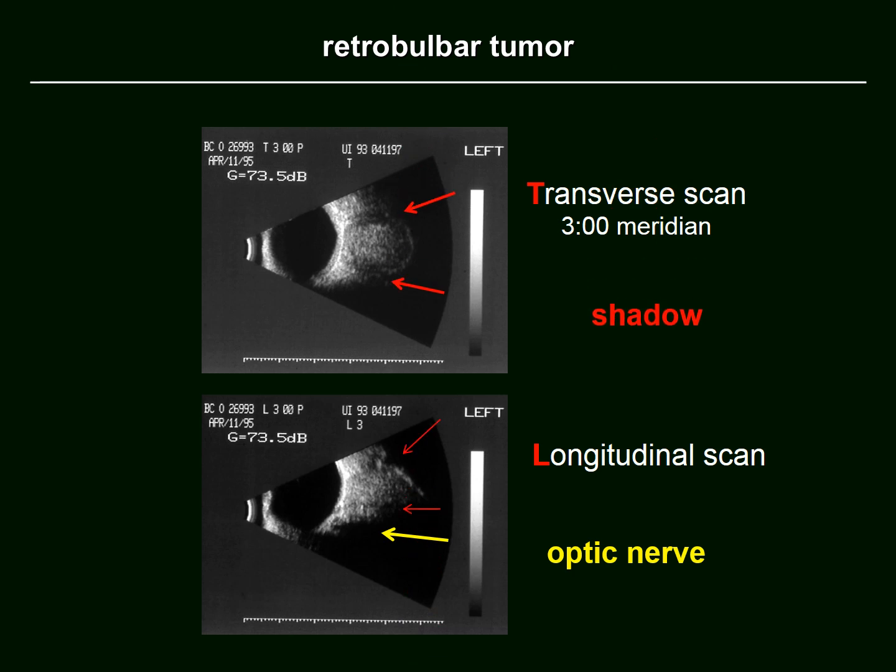These are shadows cast by the anterior surface of the capsule of the tumor, reached by an oblique sound beam, again a consequence of refraction of the beam and total reflection. We'll talk about this in detail later.